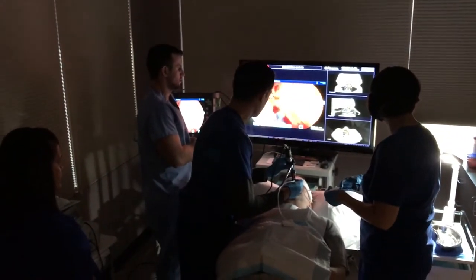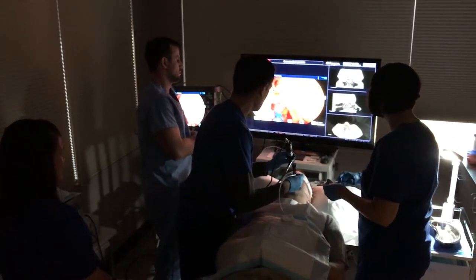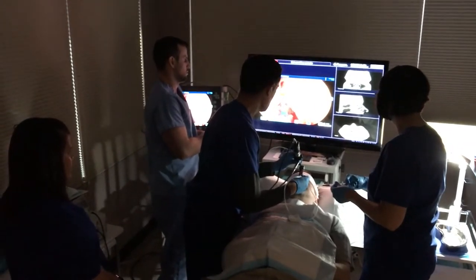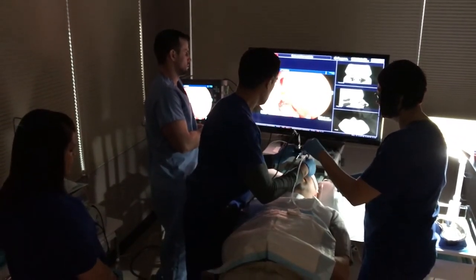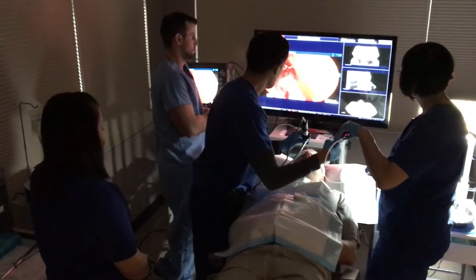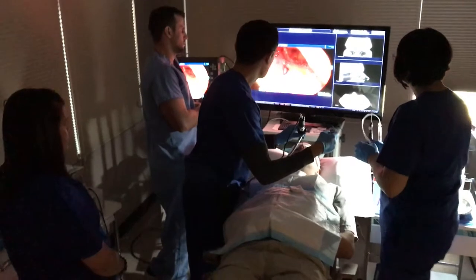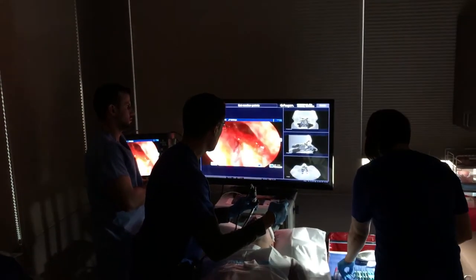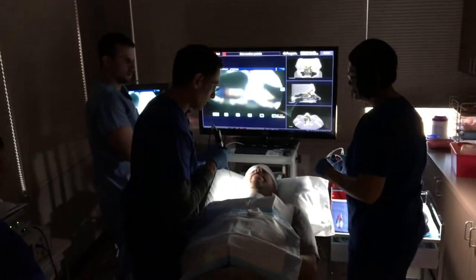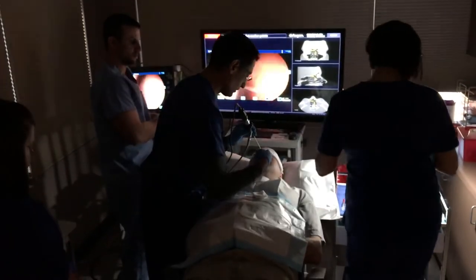We're going to inflate now. Okay. One more time here. Now I'm going to take this out here, and then you can see all the way up into that sinus — forehead sinus. And then let's go and do the other side here.